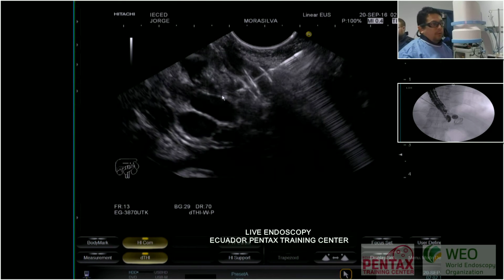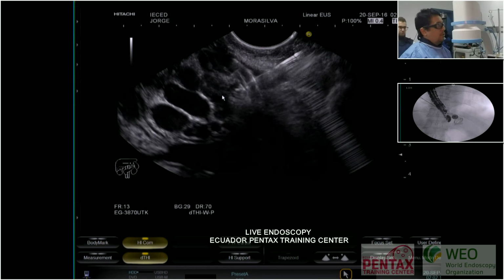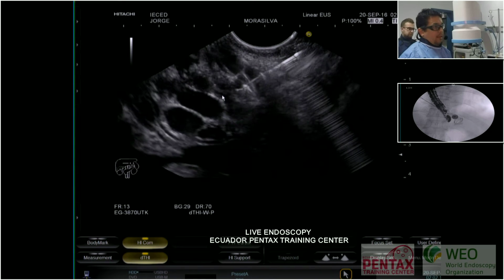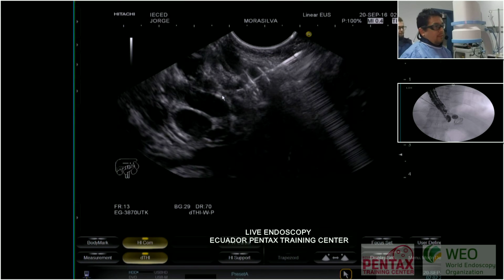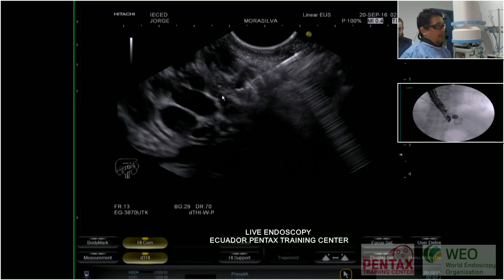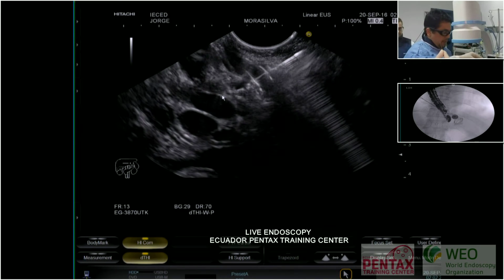So I will put another one. You can use, in this case, another of the same diameter and the same length, but we will put another one of 14 millimeter after deployment.